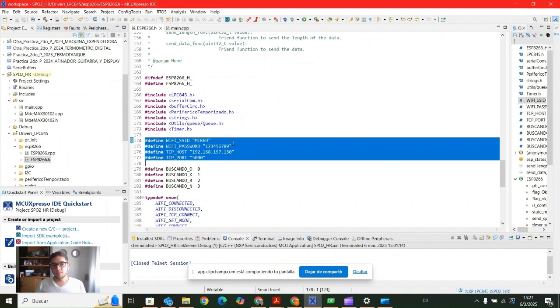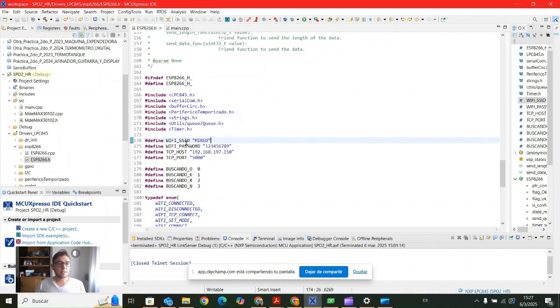We are going to look at Wi-Fi SSID. This is going to be the name of our Wi-Fi network that we are going to try to set up, previously in our mobile phone in hotspot mode. It is important to choose a name that has no white spaces nor any kind of special characters. So let's consider, for example, this one, Mi Red. You could choose upper characters or whatever you like. In my case, I chose upper characters.